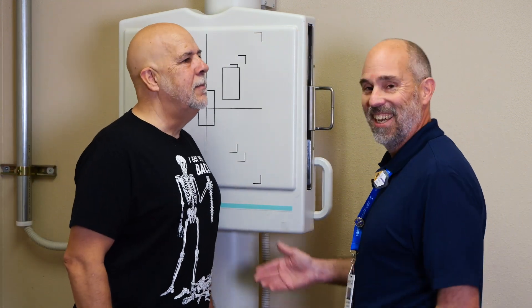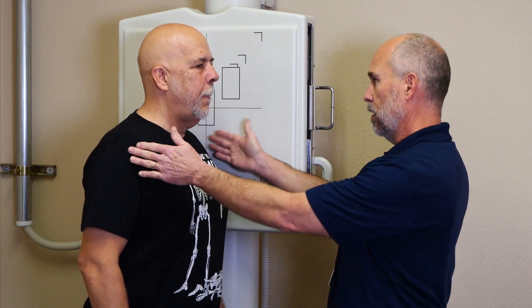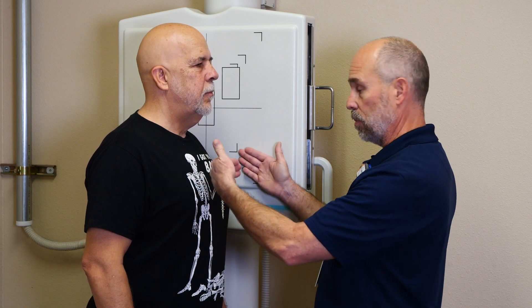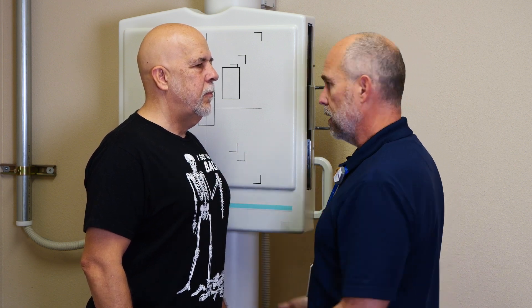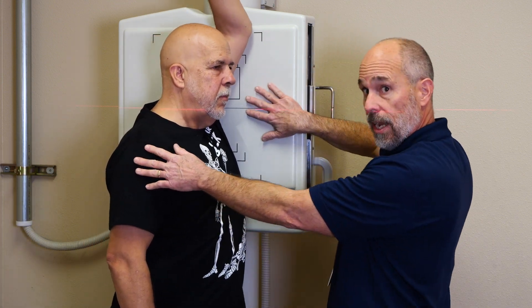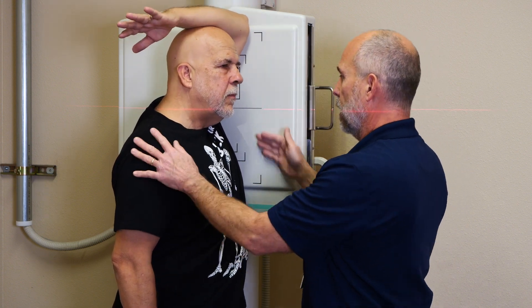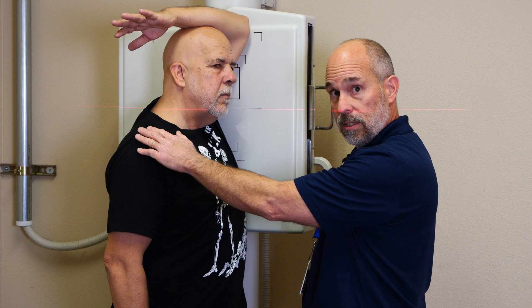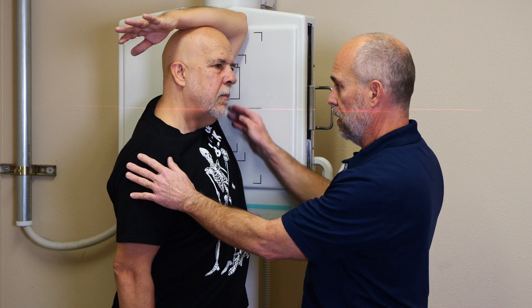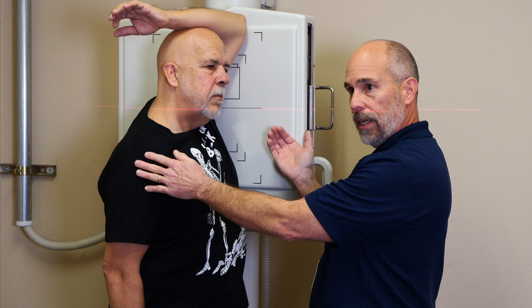We're going to start out in a true lateral position. Make sure the patient's body and head are in the true lateral. The mid-coronal plane is perpendicular to the IR. We're going to have Glenn elevate his left arm — the side closest to the IR — and rest the arm on his head. Then we're going to have him depress the shoulder away from the IR, kind of reaching down towards the knee. Then we can rotate the shoulder back just a little bit to offset the humeral heads.